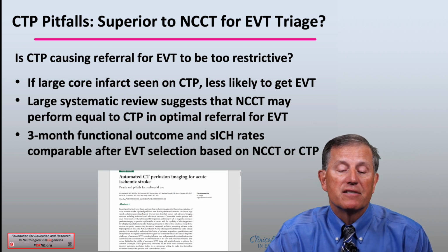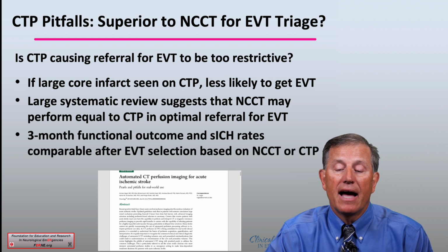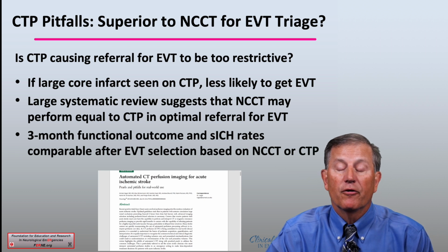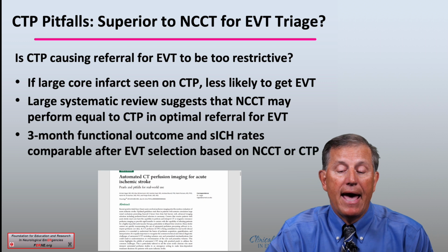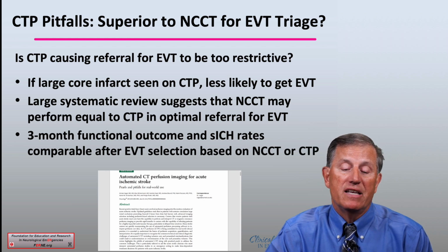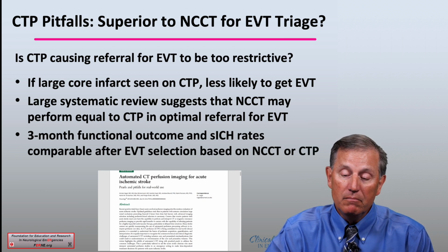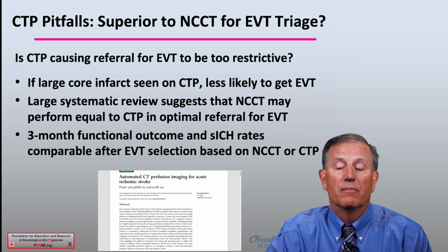And a large systematic review listed here does suggest that a non-contrast CT may perform equally well to CT perfusion in the optimal referral for EV therapies. And in fact, the 3-month functional outcomes and symptomatic intracerebral hemorrhage rates were comparable in patients who received EVT based on selection with simply a non-contrast CT or CT perfusion.